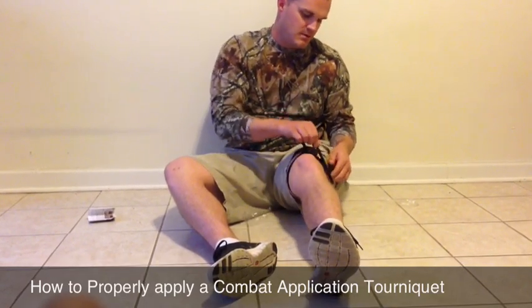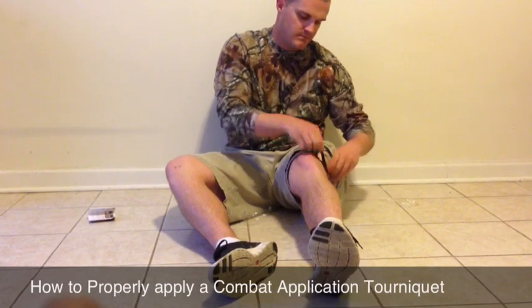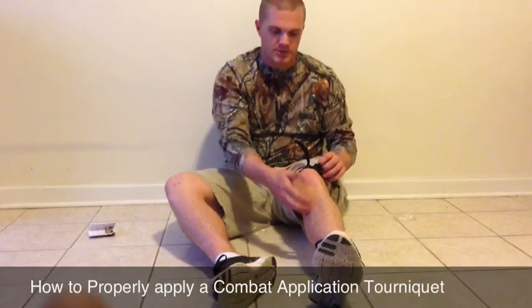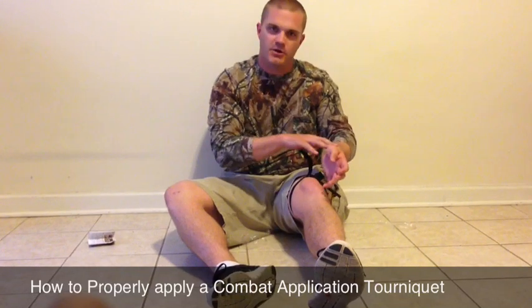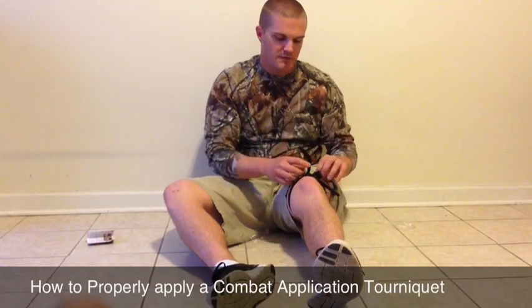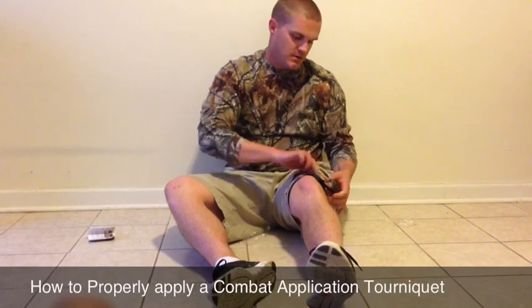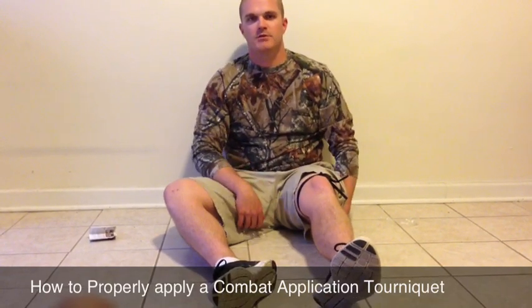Pull it tight and crank down your windlass. If you want to check if you're doing it right, you can check for your pulse. If you do it on your arm, check for your pulse — if you can't feel your pulse, then you've done it right. Secure it, and you're all set.